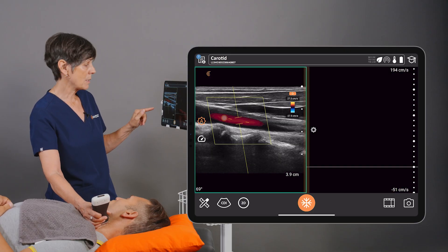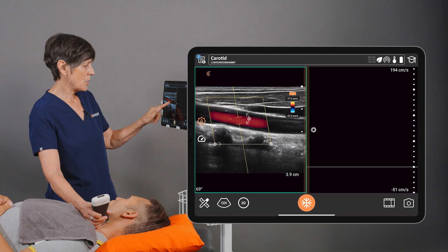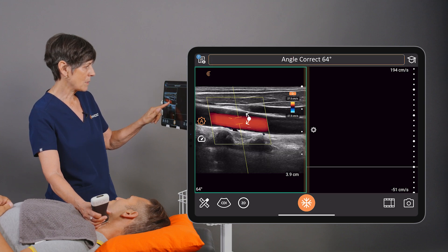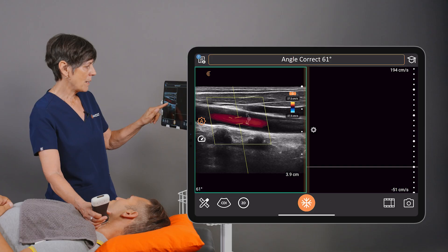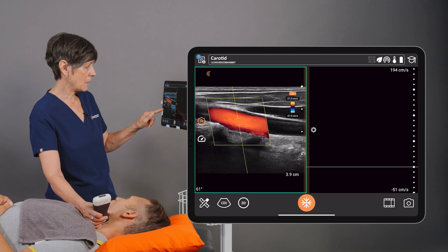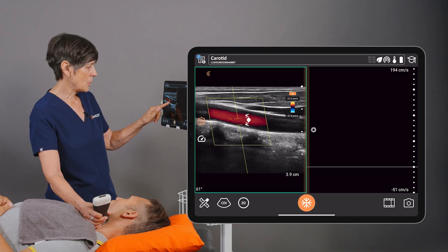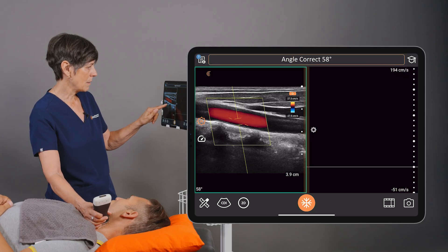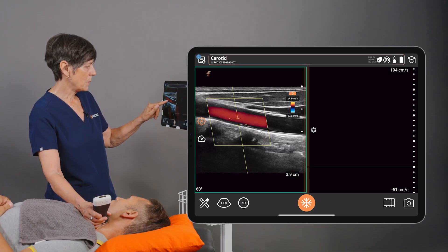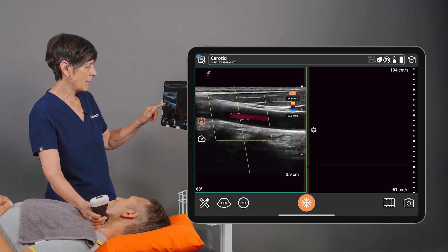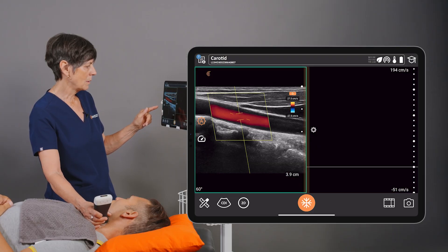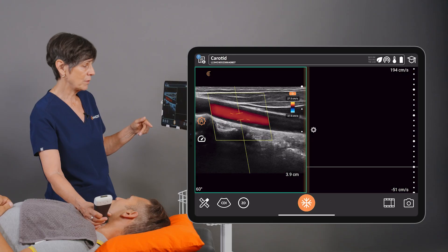Notice that there's an angle correction here — you can adjust that angle and it's displayed at the top of the screen. You never want to be over 60 degrees, as it introduces too much error into the calculation. I'm going to adjust that to 60 and make sure that line is parallel to the back wall of the vessel, or parallel to the blood flow.